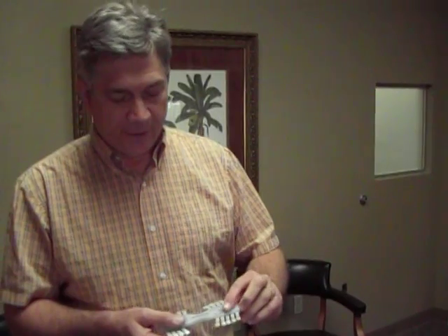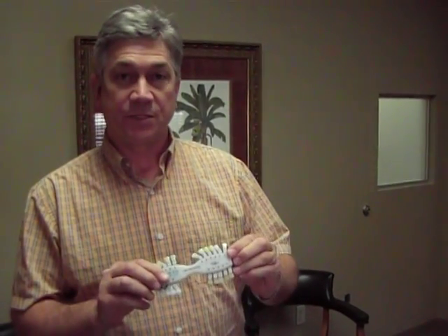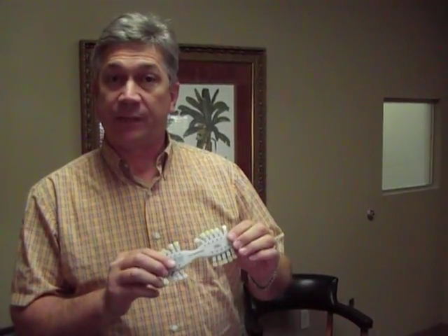Today I want to talk about taking shades in your office and trying to get the right shade to your laboratory. Every dentist should have the same shade guides that the lab has, and they should correlate with the porcelain that the lab uses. For instance, these shade guides here relate to each bottle of porcelain that I have. This shade guide right here is A1, A2, A3 porcelain, and that's all it is. It shows the A1, A2, A3 porcelain.